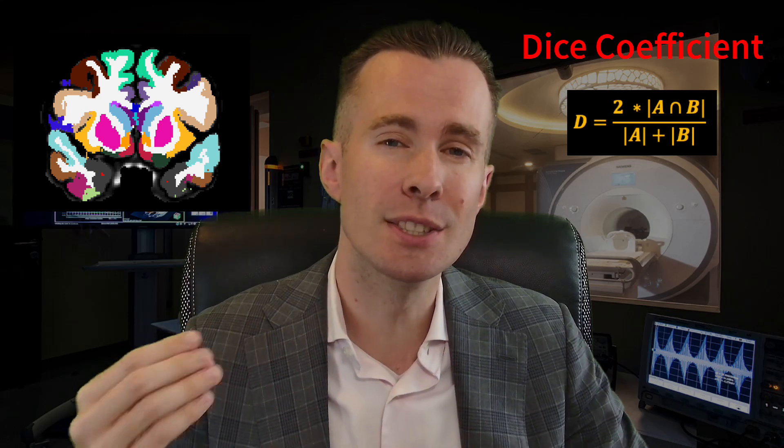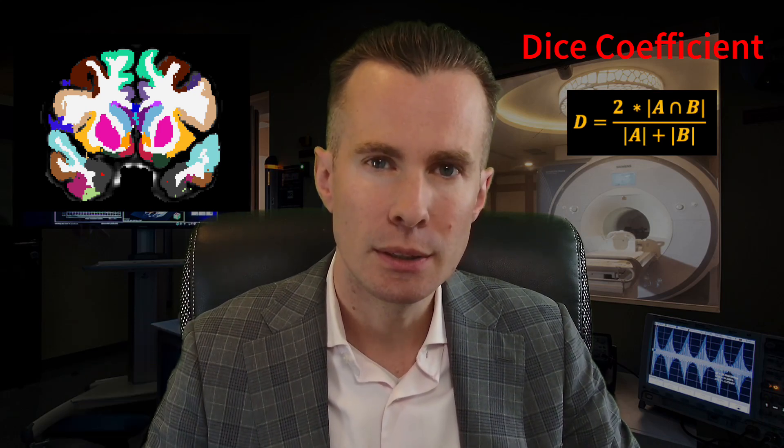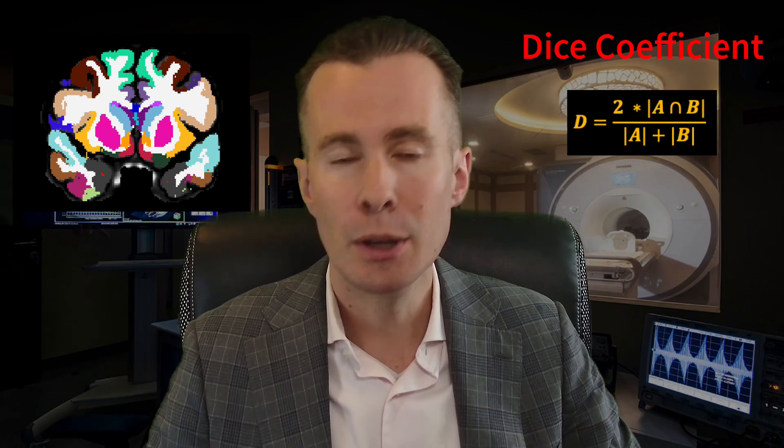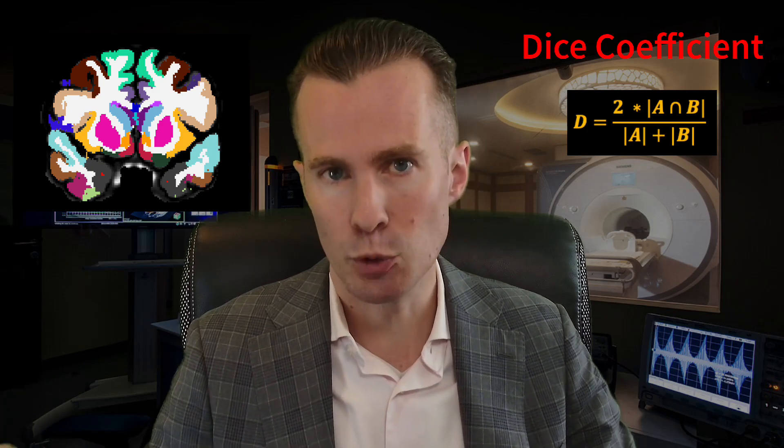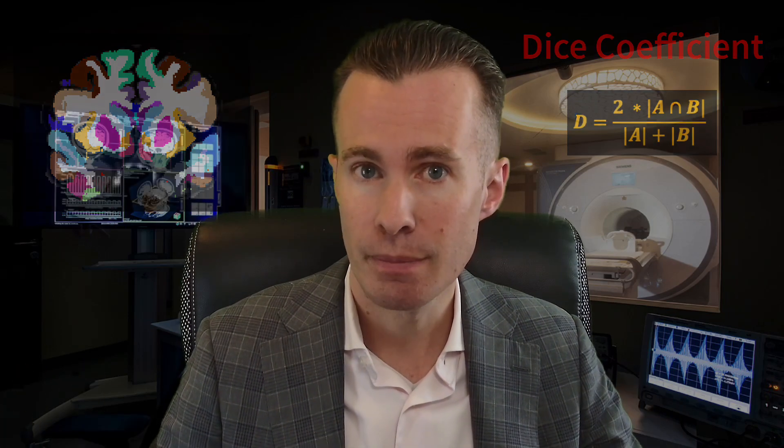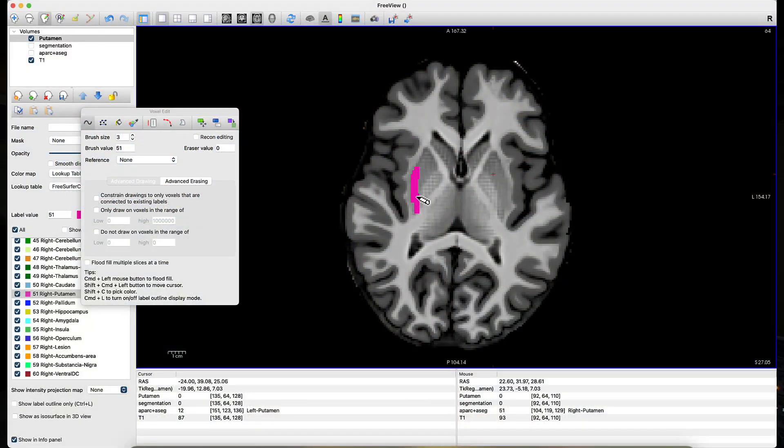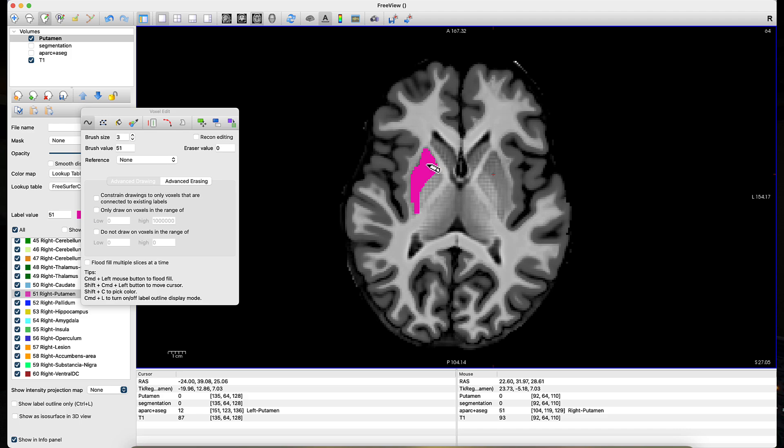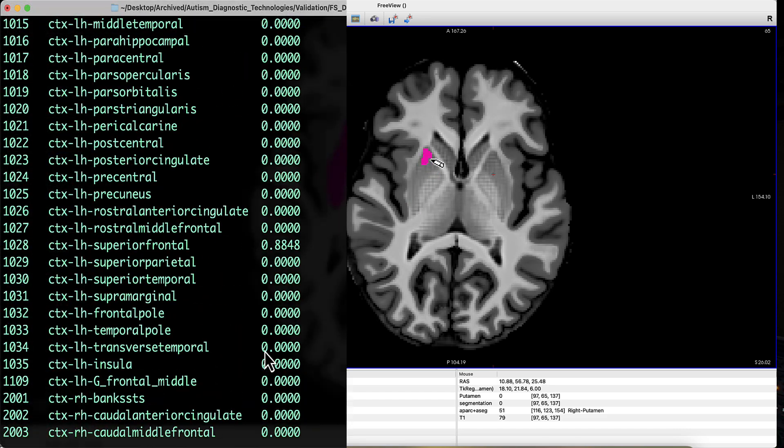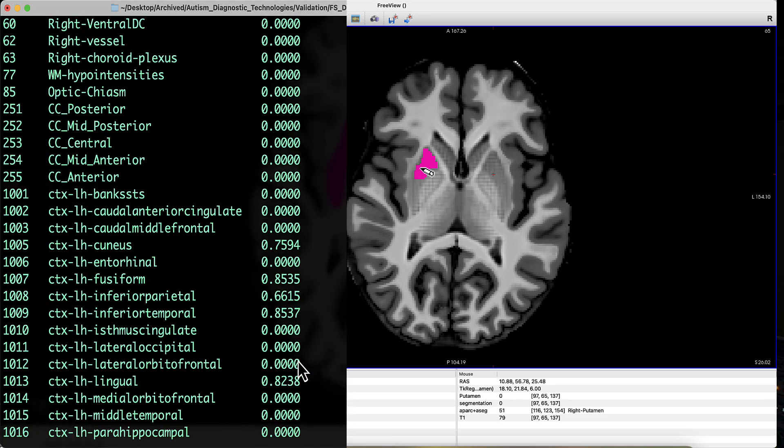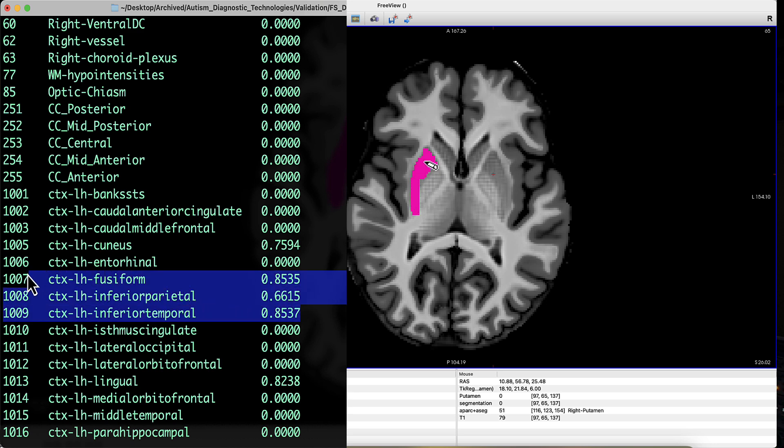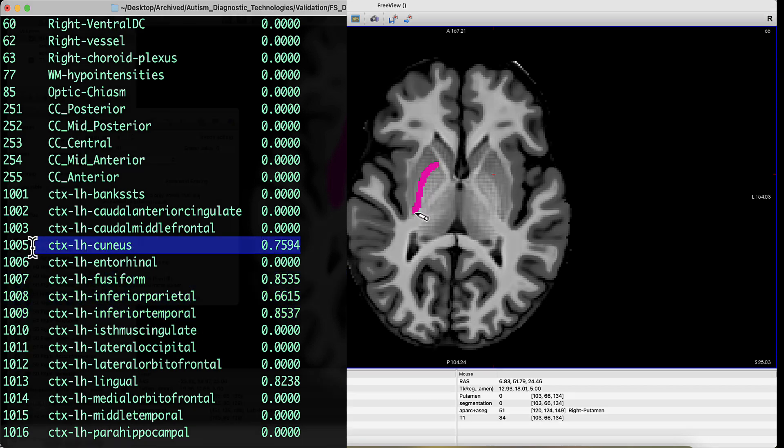This provides a very simple clear metric to measure the amount of overlap or agreement between different researchers' segmentations. In this tutorial, I'll be showing you how to use Freeview, part of the FreeSurfer imaging suite, to create your own regions of interest and then to calculate the dice coefficient between your segmentation and somebody else's or against the segmentations automatically generated through FreeSurfer's ReconAll program.